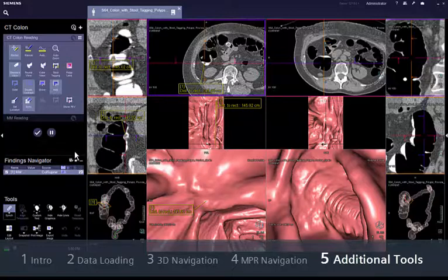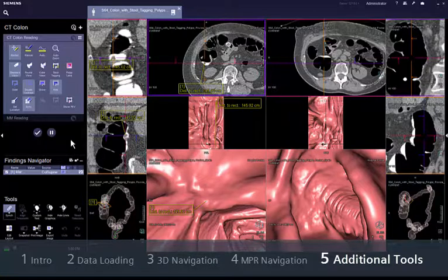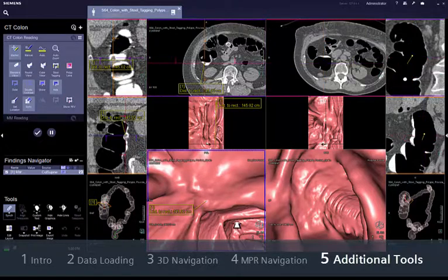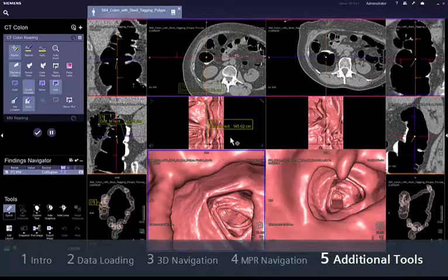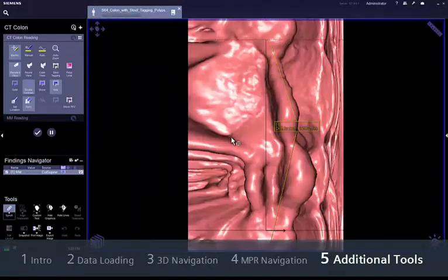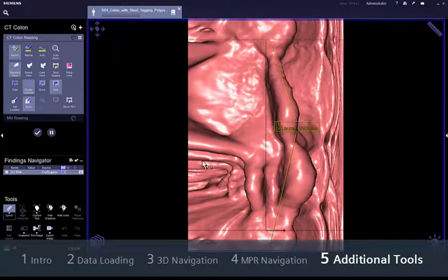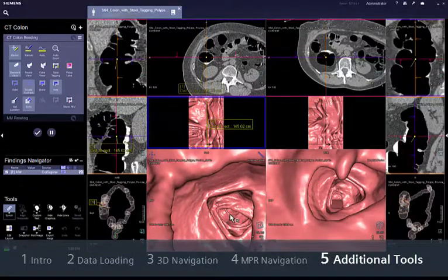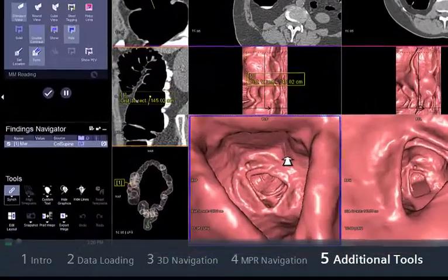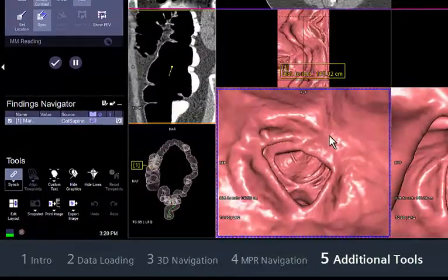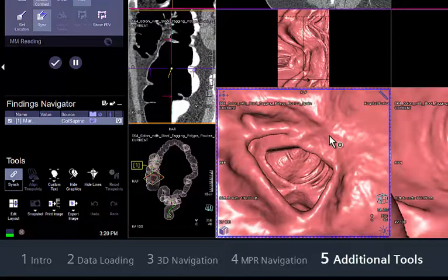To help increase your confidence that you have detected all relevant lesions, Syngovia provides tools such as automatic virtual dissection, faecal tagging and stool removal, or PEV polyp enhanced view. The virtual dissection view is automatically synchronised with the endoluminal view, showing a virtually unrolled colon behind and in front of the virtual endoscope position. This view allows you to diagnose the colonic surface without missing anything, for example behind the folds of the colon.